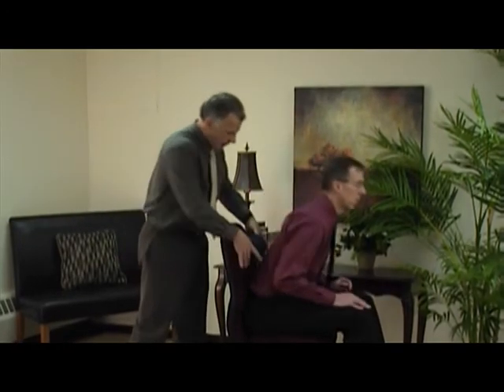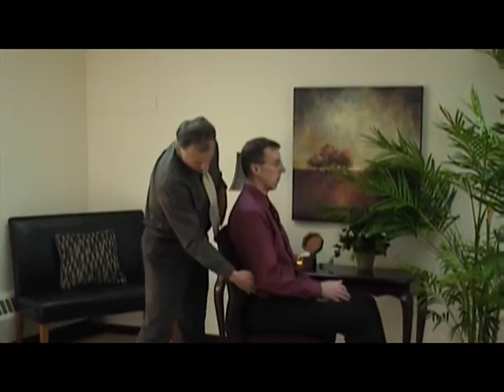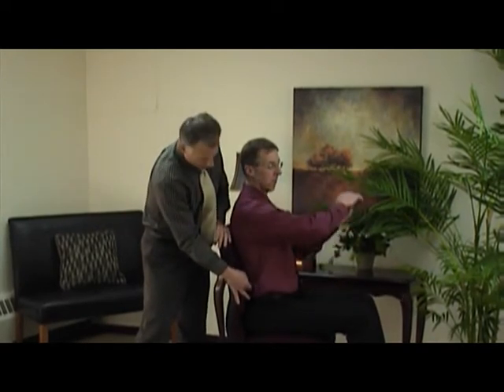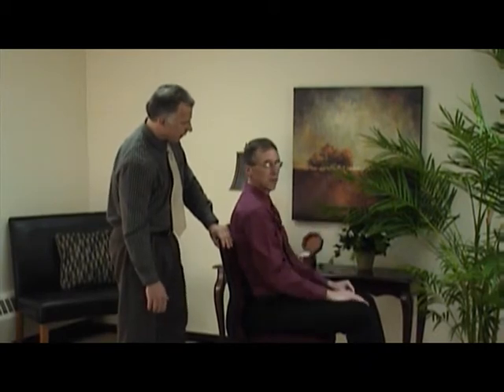Okay, now if you need more, we're going to take the lumbar support here. Like again, the McKenzie support is excellent. I really like it. Why don't you lean forward, Bob? And we're going to put it in there. And why don't you go ahead and lean back. Now it's hard to see it right here in the camera, but Bob, can you tell me if that's in the right location? It actually is. It actually feels really good.